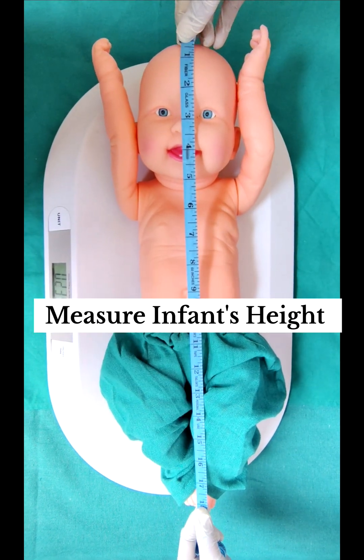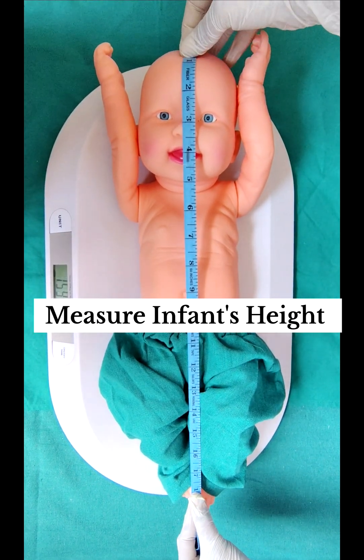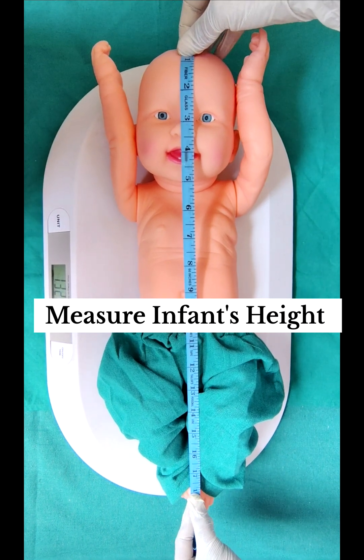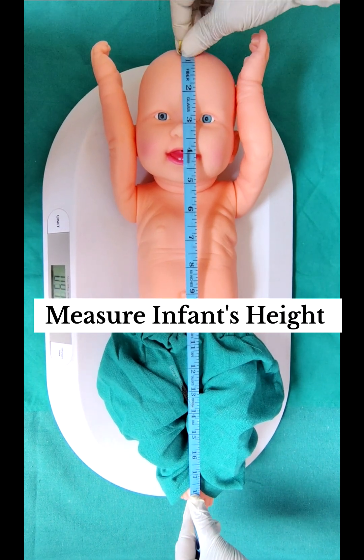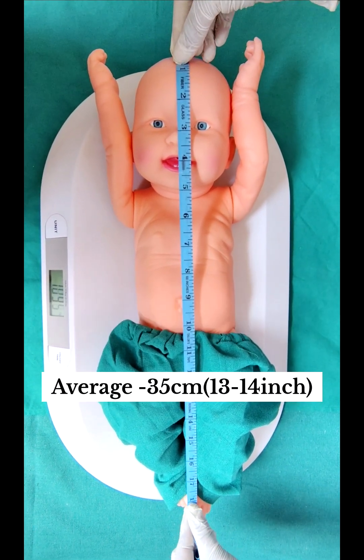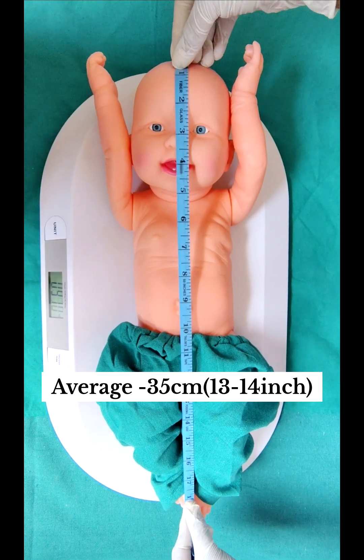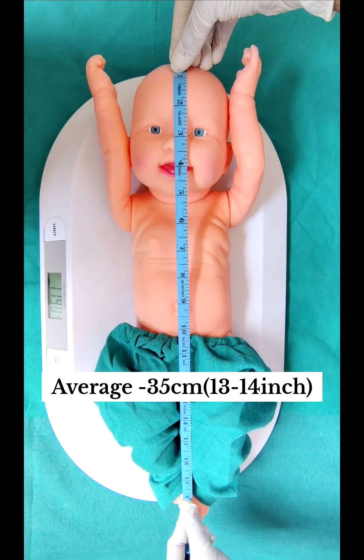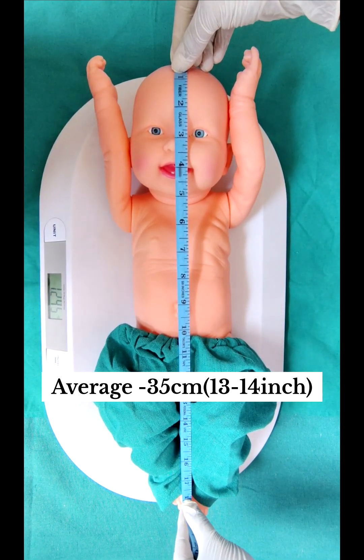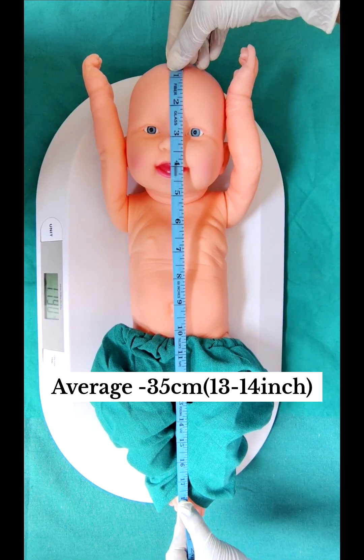Measuring newborn height: place the child on an infantometer. The goal is measuring head to heel. The normal length of an infant from head to heel is around 35 cm, approximately 13-14 inches.